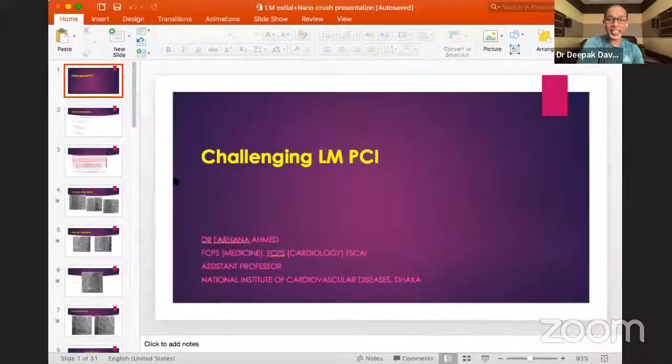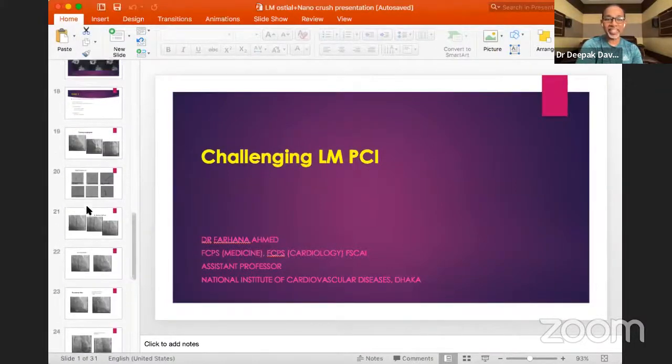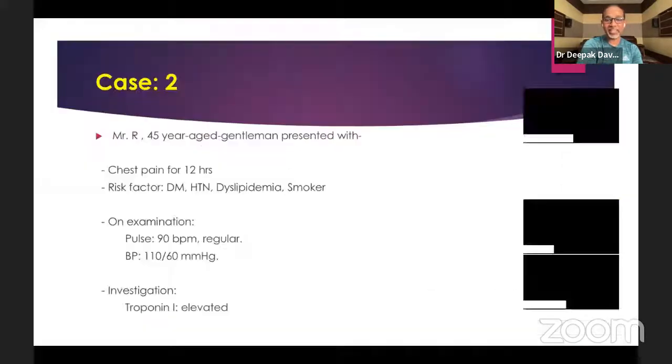Yes. In retrospect, since the IVUS catheter was open, probably the RCA also should have been evaluated just to see if there was disease. Yeah, no doubt it's definitely spasm and nothing needs to be done for that, just to evaluate it. And I felt that probably we need to go one step ahead and evaluate ESR, and with both the ostia being involved with no other significant disease of the other vessels, one should also think in terms of other causes of coronary artery disease rather than just atherosclerotic. Absolutely.